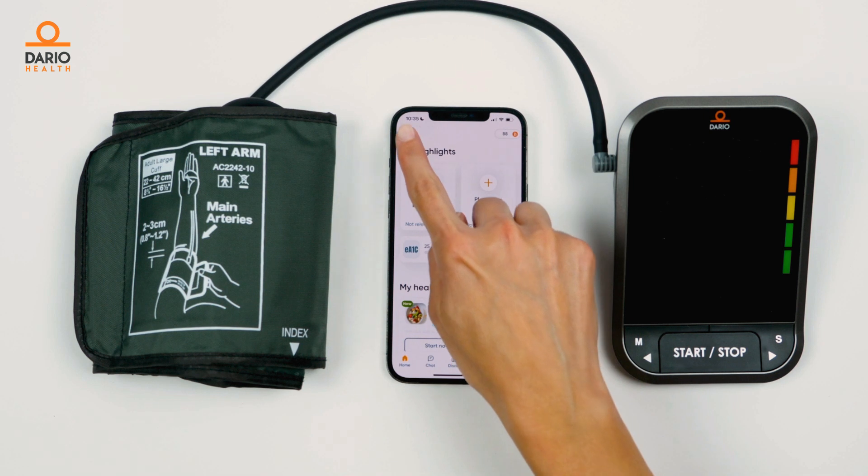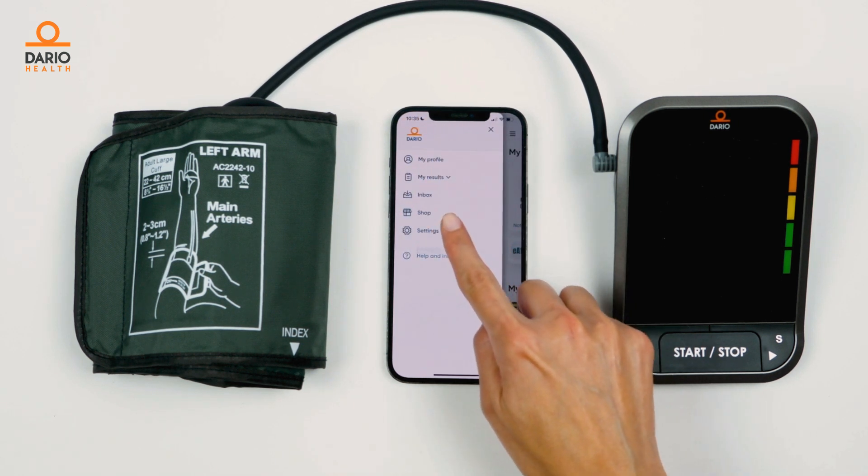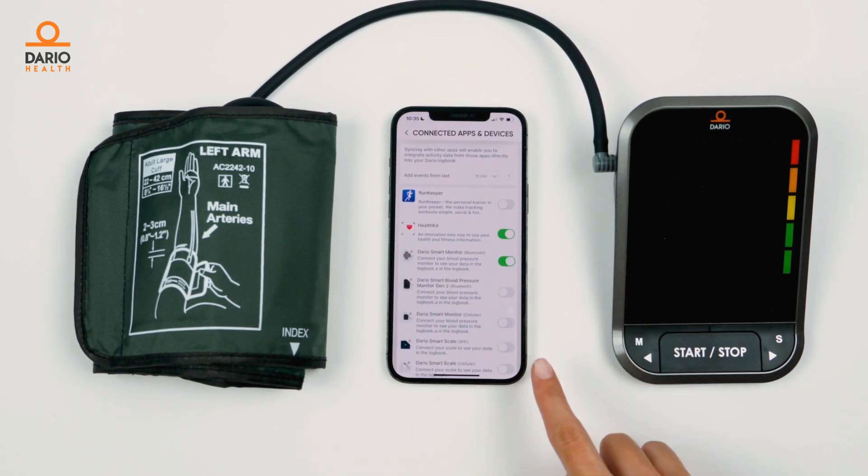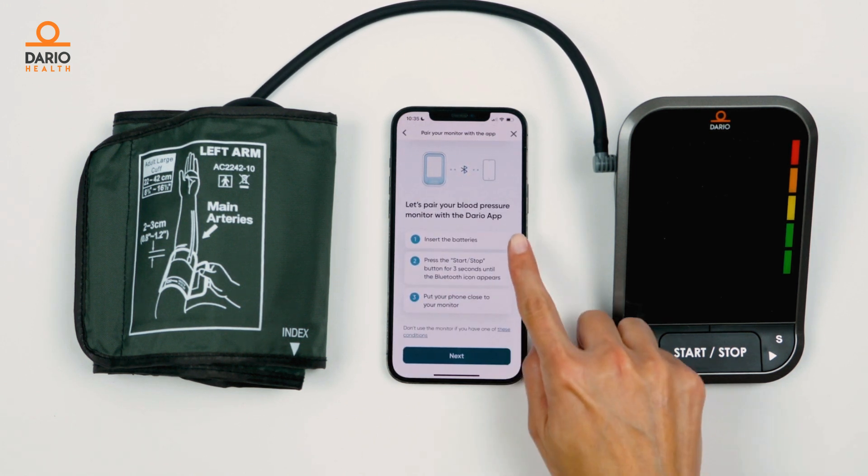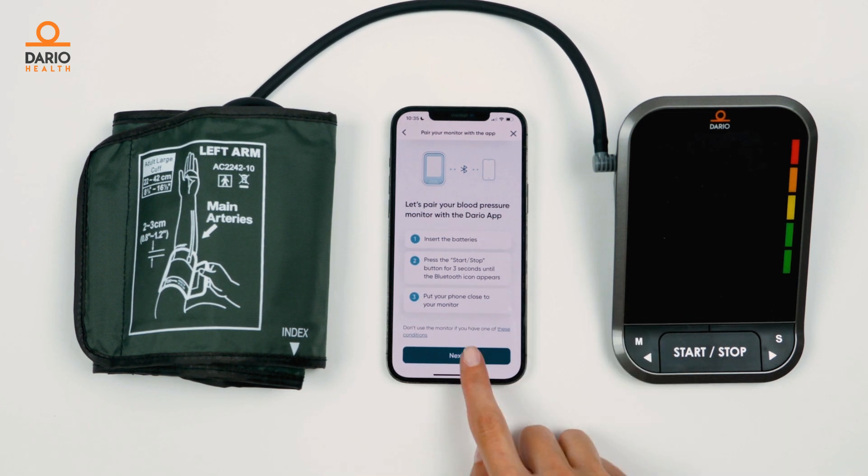Open the Dario app, go to the menu, find settings and then connected apps and devices. Enable pairing by turning the Dario smart monitor Bluetooth toggle on. Follow the app instructions to finish pairing.